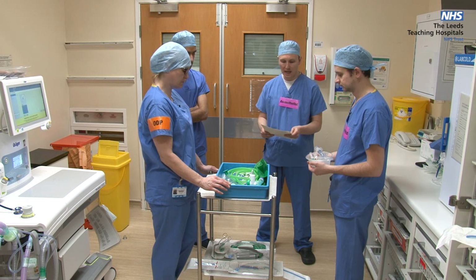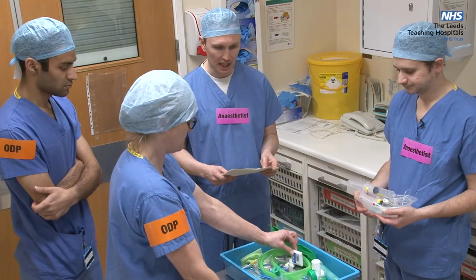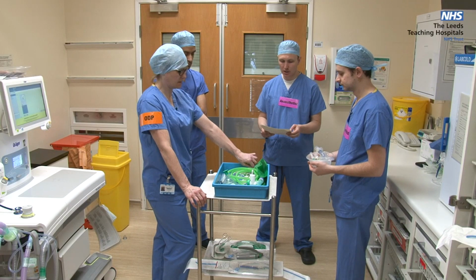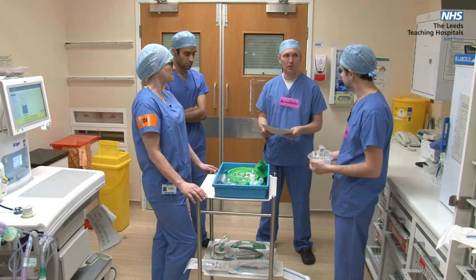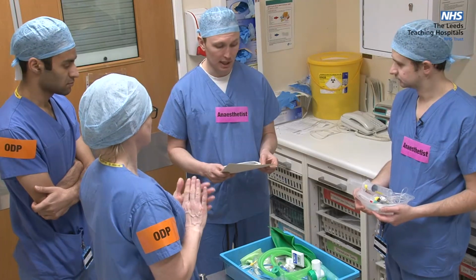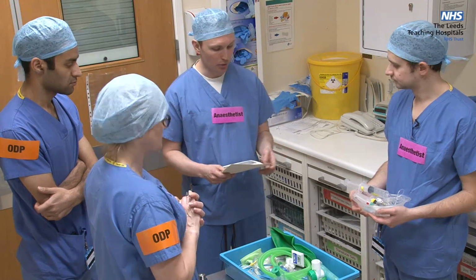We've also prepared the following equipment. So we have a video laryngoscope. Yep. And we've checked the battery on that. Yep. We have an appropriate blade for that laryngoscope. Yep. Monitoring, we have ECG, SATS probe and non-invasive blood pressure on the patient in the room. There's a capnograph block in the room. Suction and Yankauer is in the room.